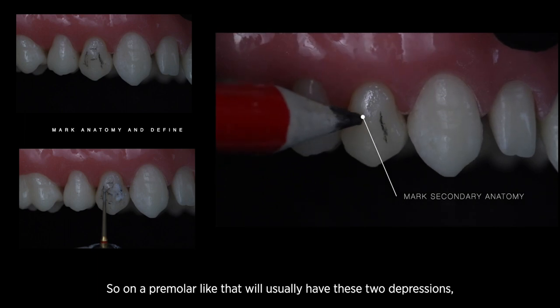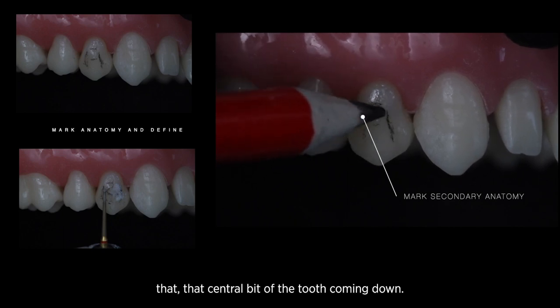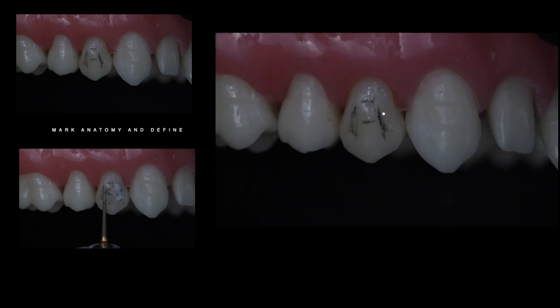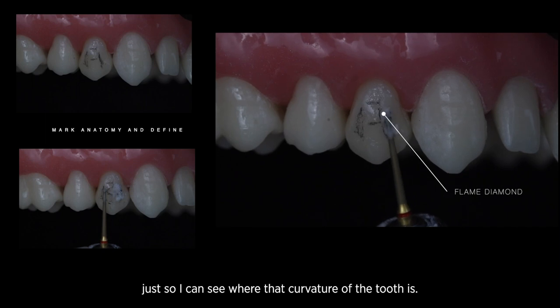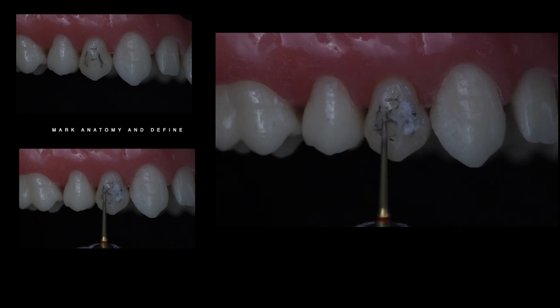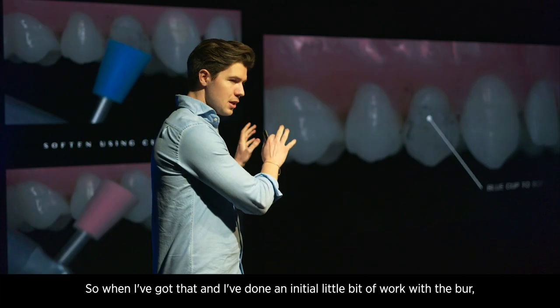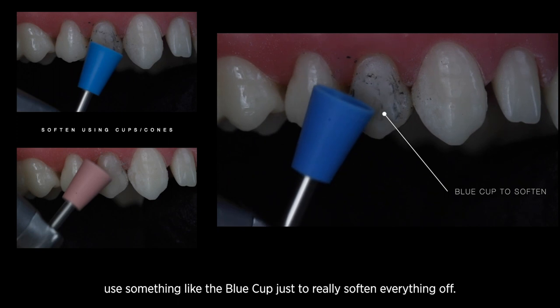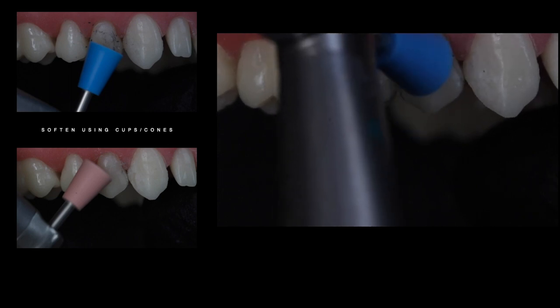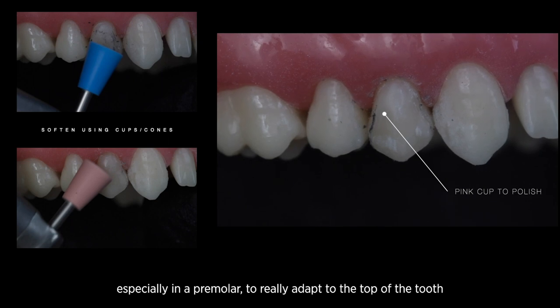Step by step, finishing and polishing a Class 5 restoration. First, I'm going to mark the secondary anatomy — on a premolar like that we'll usually have two depressions either side of that central portion of the tooth coming down. I'm also just going to mark a little detail towards the tip of the tooth, just so I can see where that curvature is, because teeth don't come down flat — we have an emergence profile that flattens off and tapers back towards the incisal edge. Once I've done that initial work with the burr, I'll use the blue cup to really soften everything off, with that nice wide surface area adapting to the top of the tooth.